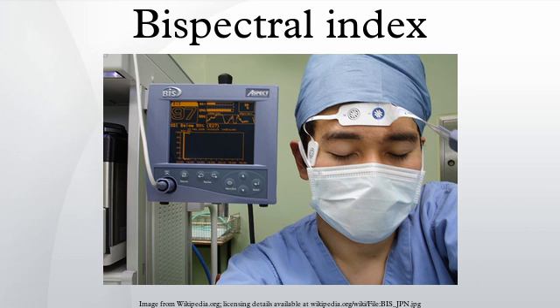In some cases, the BIS may underestimate the depth of anesthesia, leading the anesthetist to administer a higher than necessary dose of anesthetic agent. In such cases, the patient may be anesthetized to a lower BIS level than is necessary for the surgery or procedure. This is called treating the BIS, and may result in a deeper level of anesthesia than required.